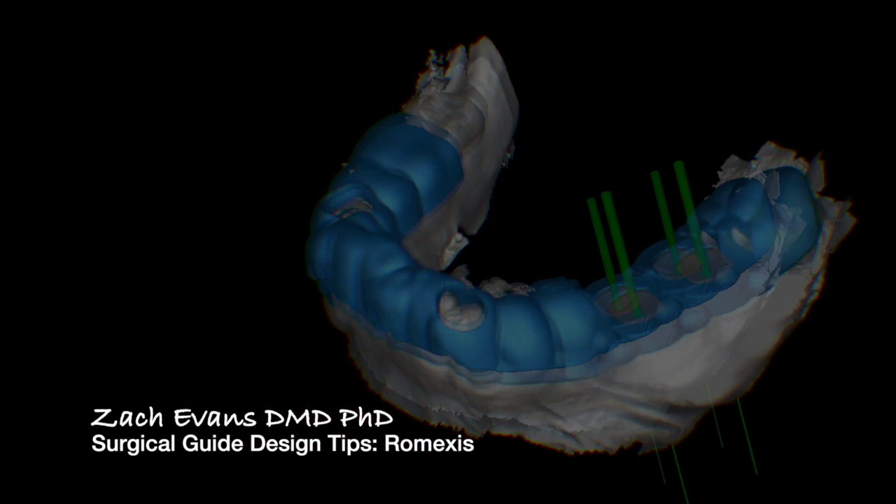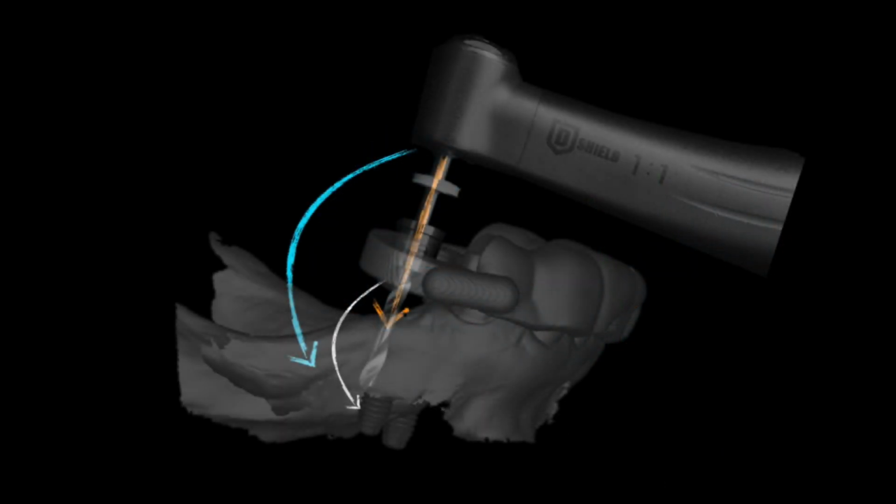I am going to share a video tutorial with you that I think will help you avoid some common mistakes that I see all the time. In the posterior mandible especially, if you have an edentulous span, whether it's unilateral or bilateral, I see the risk with guided implant surgery all the time of the potential for guide unseating with downward pressure in that edentulous space. So especially if you have multiple implant sites, and especially if you're doing the case flapped, you don't really have any guide support in that edentulous space. So let's think of a case, for example, where you have, I don't know, teeth 20 to 28. If you are placing implants posterior, there's not a lot of AP spread that will support the guide when you're drilling. So there's the potential for downward pressure while you're drilling to unseat the guide and force the implant angulation and depth to be inappropriate.